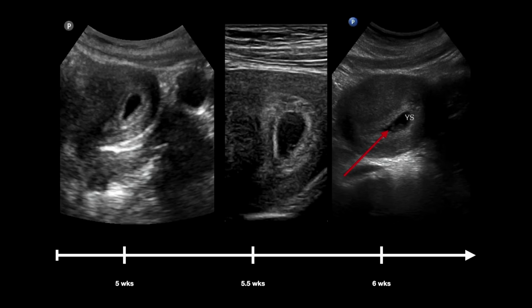And so there are a number of ways of getting at this gestational age question in the first trimester, right? The first one, we've talked about this already. If you remember back from a couple lectures ago, or if you're watching this on YouTube, if you scroll back a couple videos, we talked about ways of measuring fetal loss and things like that. In those lectures, we talked about the normal early progression of pregnancy, right? Because that has impacts in terms of what metrics we use to describe viability of a pregnancy.